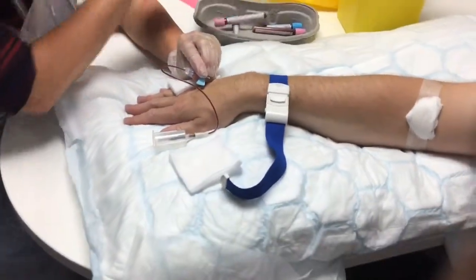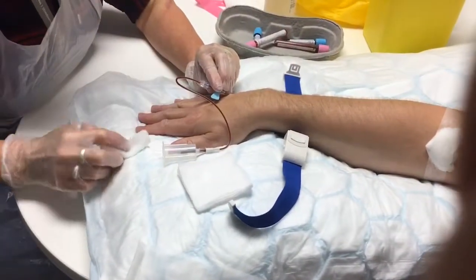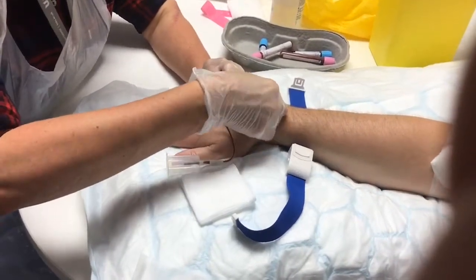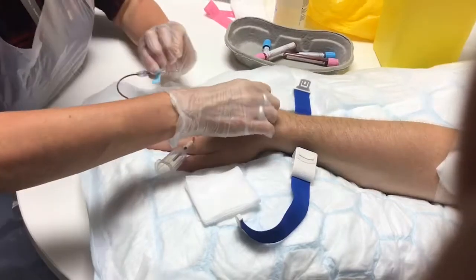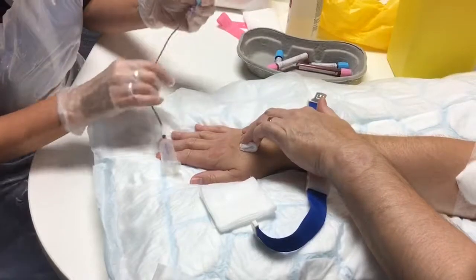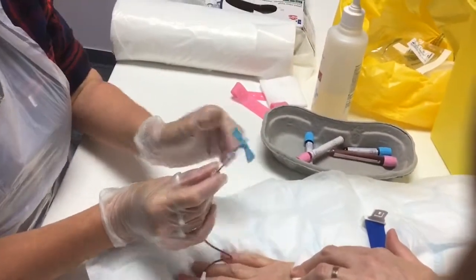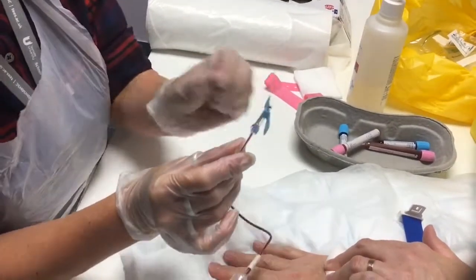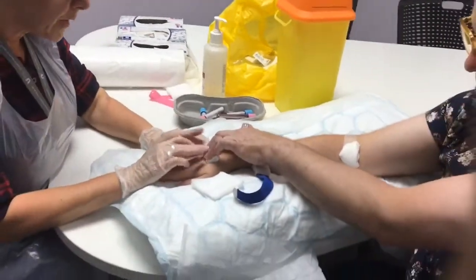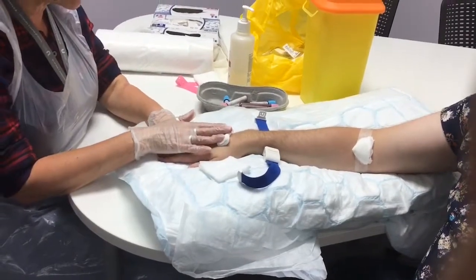Once you're happy, release your tourniquet and get your piece of gauze. Because the vacuum's off there's no more blood coming out. Don't press on the needle — hold it over, remove it, and press firmly. These do sheath — press that bit and push it up, it sheaths for safety. But if you have a battle with it, don't worry, just put it straight into your sharps. Apply some pressure, pop some tape or a plaster on once it's stopped.